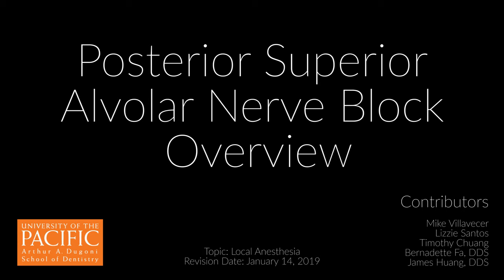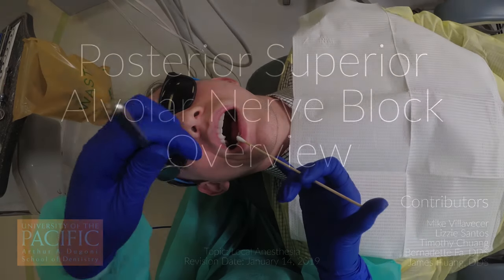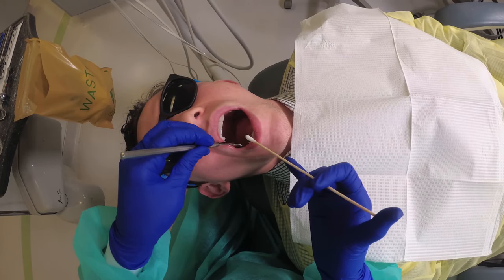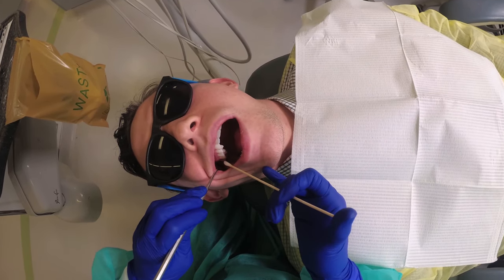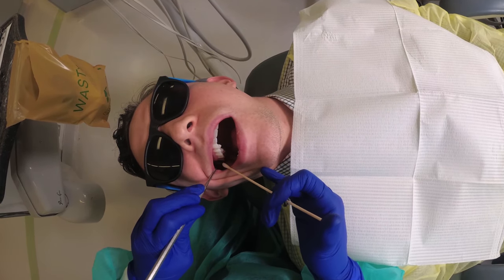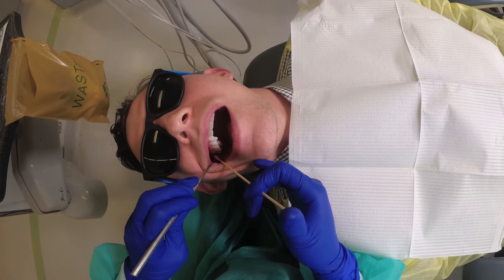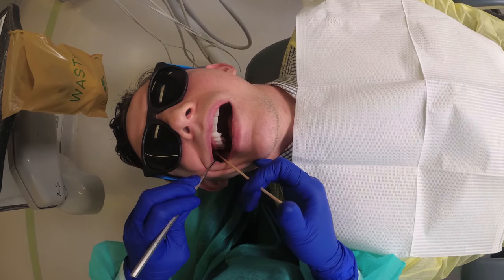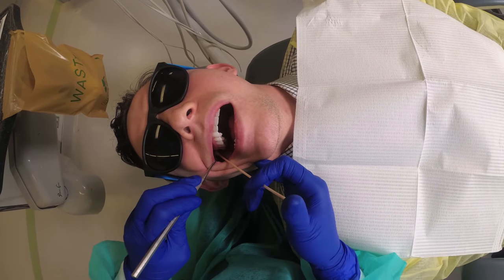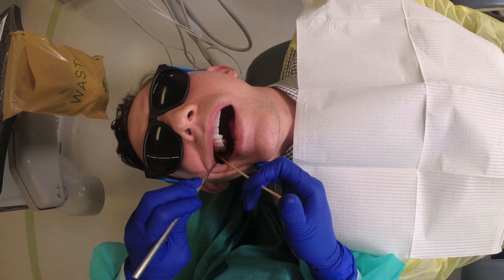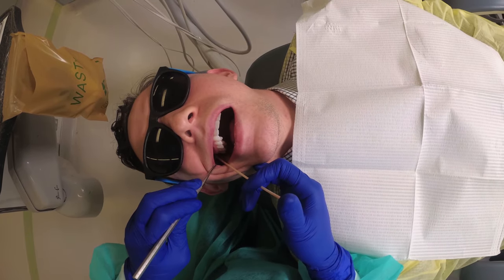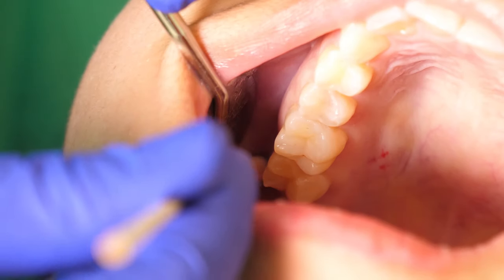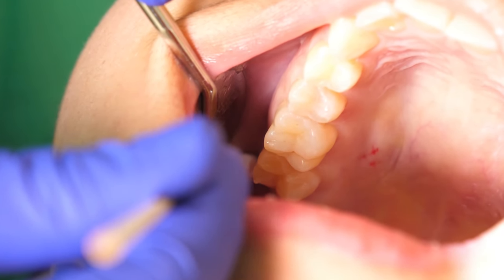Posterior Superior Alveolar, PSA. This is a visual walkthrough of the Posterior Superior Alveolar Dental Injection. The PSA injection is a maxillary block injection used to anesthetize all the maxillary molars on the quadrant where the anesthesia is placed, except for the mesiobuccal cusp of the maxillary first molar.